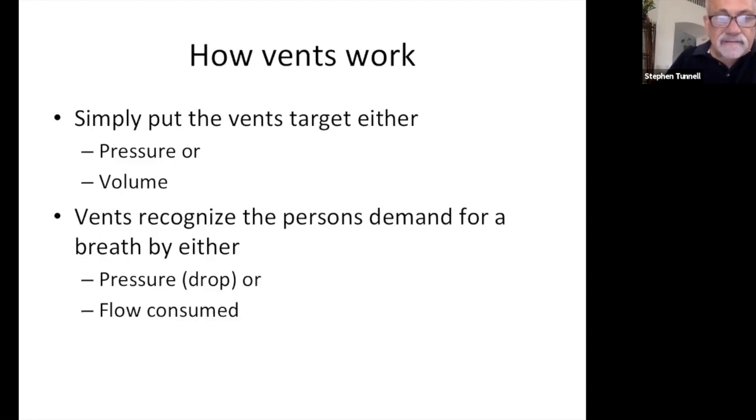Vents are very, very smart. As I mentioned before, you don't realize that's a platform doing diagnostics, therapeutics, and monitoring at the bedside, but it does. And one of the things it's able to do is recognize when a patient is asking for a breath. It does that by either looking inside the circuit and seeing that the pressure has dropped.